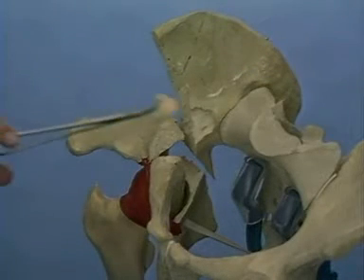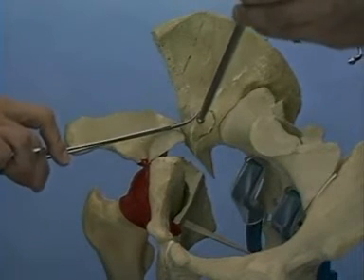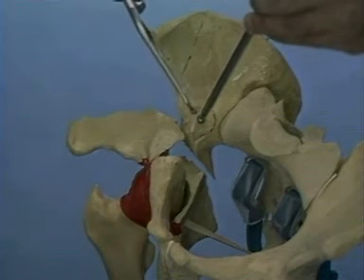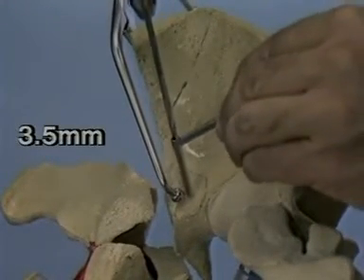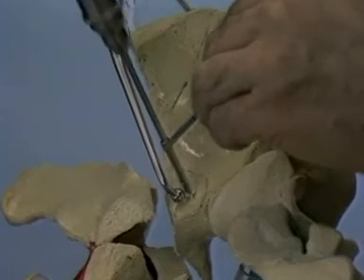The free fragment of the pelvic brim is now repositioned with the ball spike and held with reduction forceps. It's internally fixed with a 3.5 millimeter lag screw using the 3.5 millimeter drill bit followed by the 2.5 millimeter.